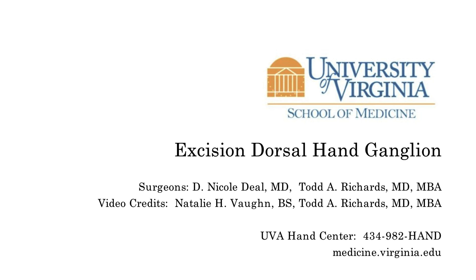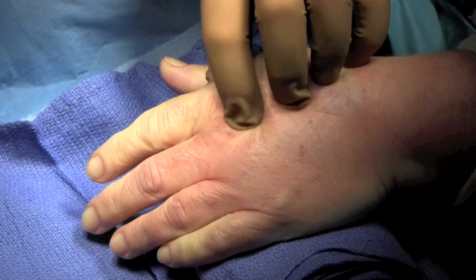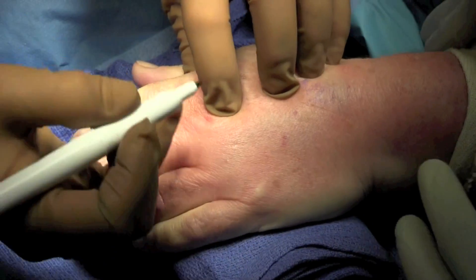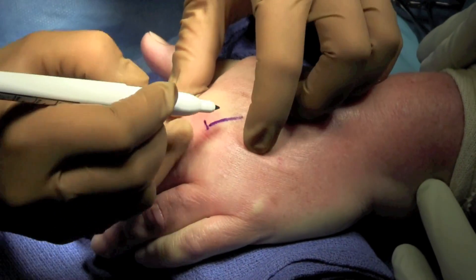This is Nicole Diehl and this video will be demonstrating excision of a dorsal hand ganglion arising from the tendon. You can see here we're palpating the mass which is between the index and the long metacarpal heads.